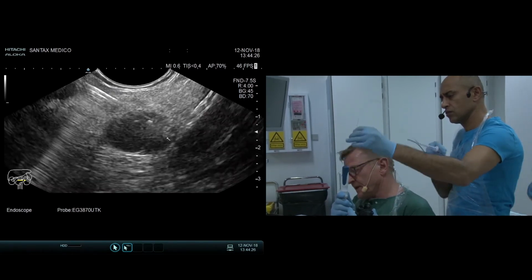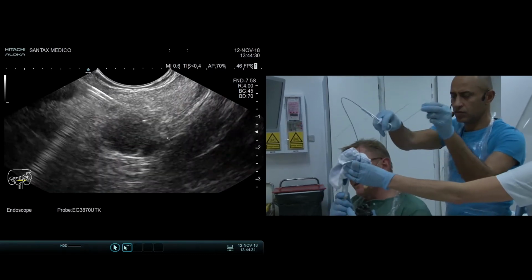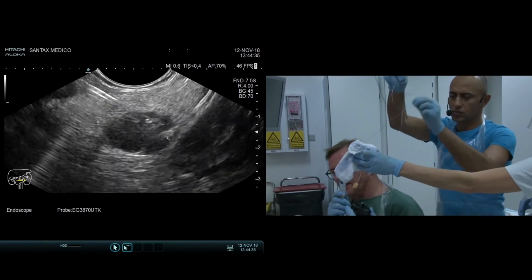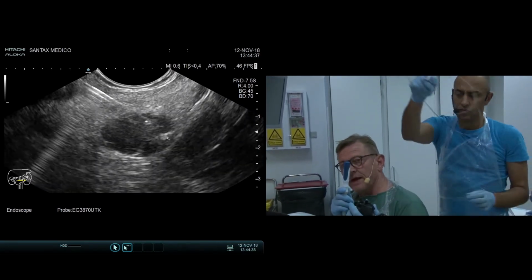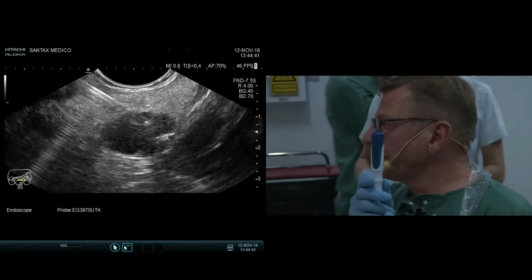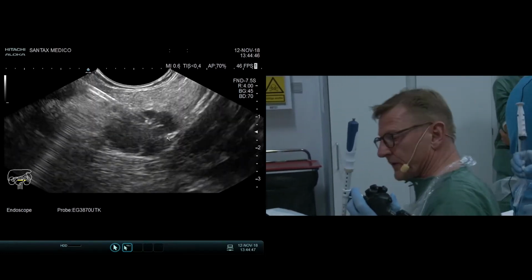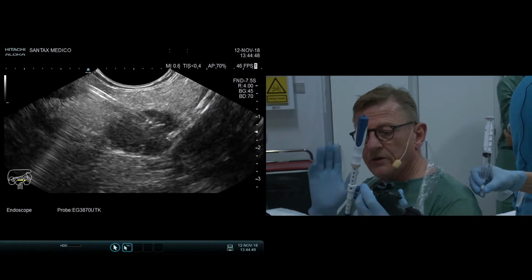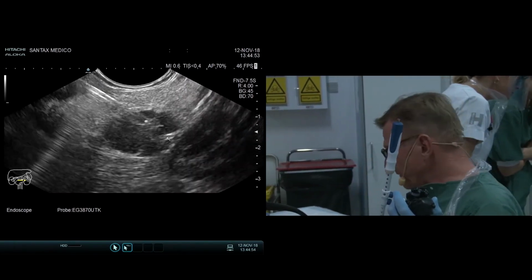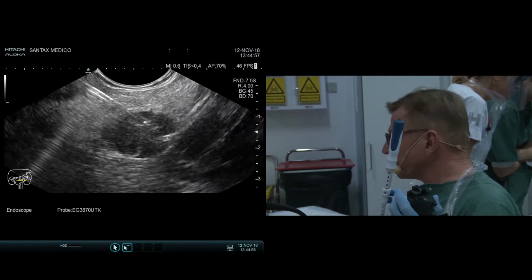You know, sometimes the specimens are really so big that it's difficult to get it into the needle again. And of course, if it is impossible, then you have to retract the entire needle and start the process over when you have taken the material out. Usually, no. We take maybe one more biopsy. It's a big specimen.